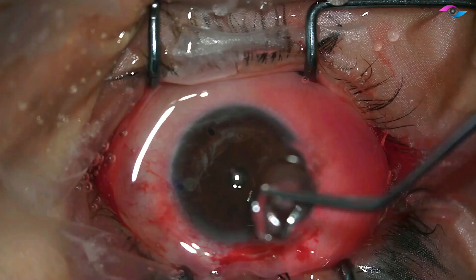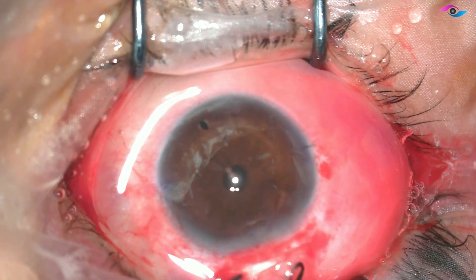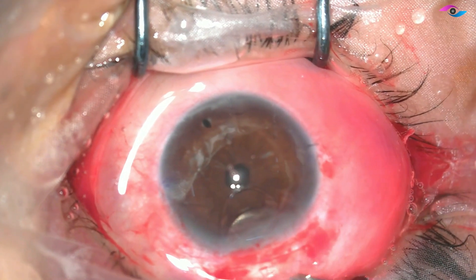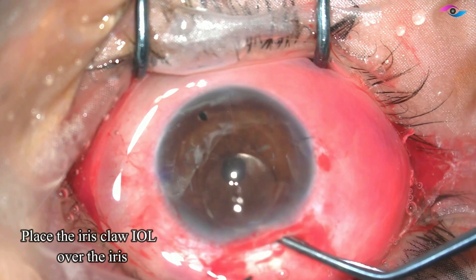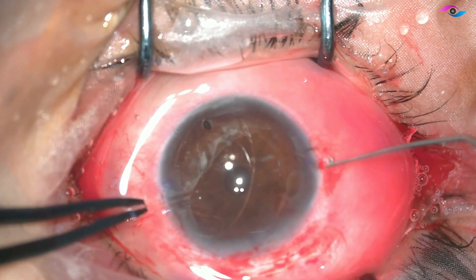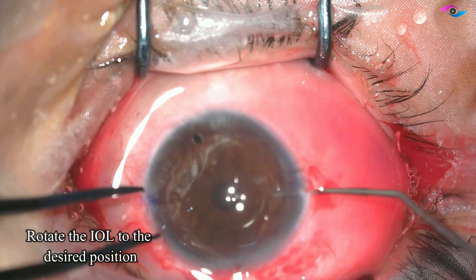Now I am entering the anterior chamber. We take the iris claw IOL and using a McPherson's forceps I am placing the IOL over the surface of the iris. First we place it on top of the iris.